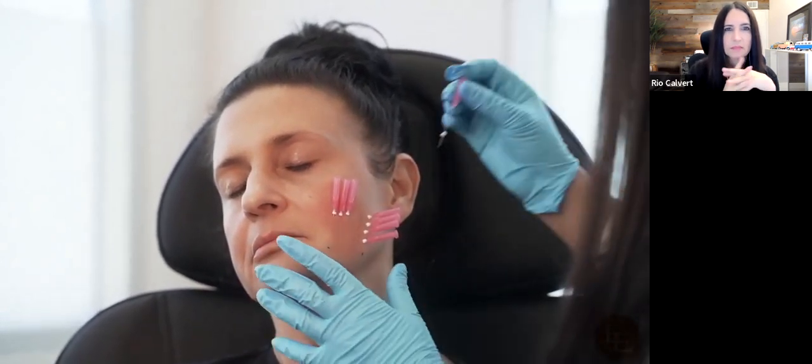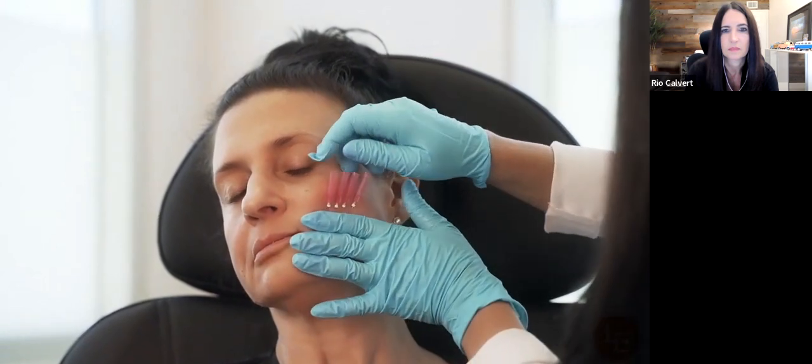Stay superficial — subdermal placement. When you're in the right plane it should go in fairly easily and be fairly comfortable for the patient. Once all threads are inserted, press, give a little twist, and remove. Press, give a little twist, and remove — and there you go.